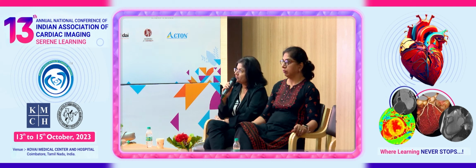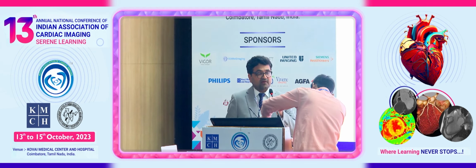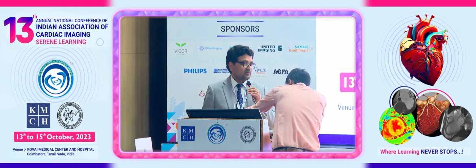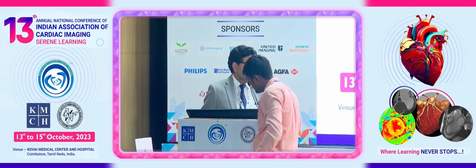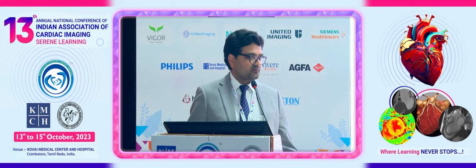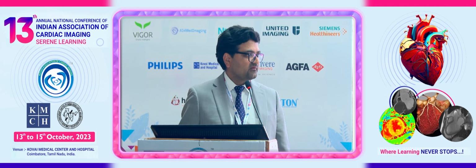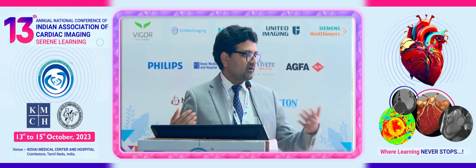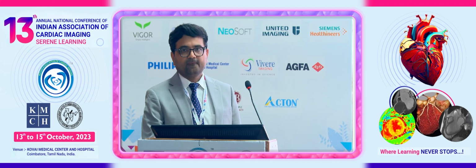Which software do you use? We are using TeraRecon for most of these cases. And we heavily rely on our 3D lab because they do a lot of these every day. If you're not doing many of them every day, then you are not confident in what you're doing. So it's important that one person, or we have three individuals, three technologists whom we have trained, do all the measurements. It's important to avoid inter-observer variation, and because they do them for all of us, they end up doing more than what we would have done individually. Absolutely.